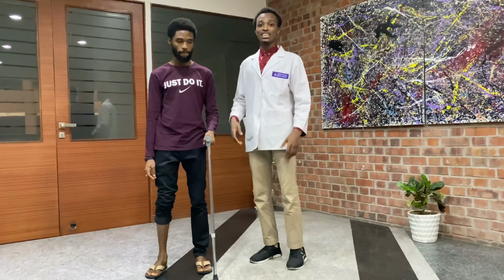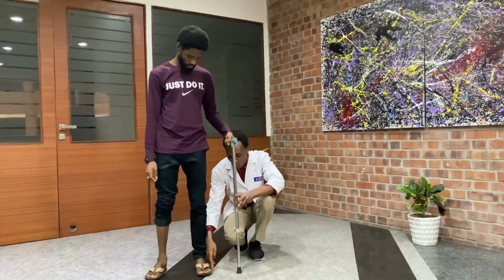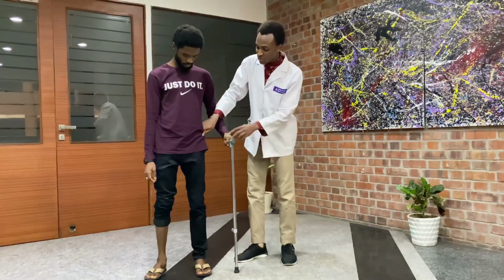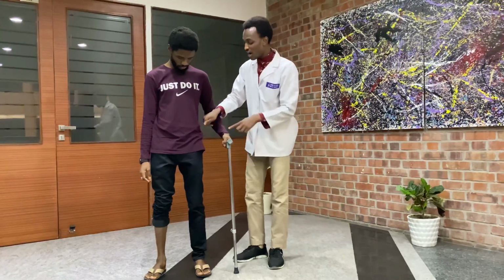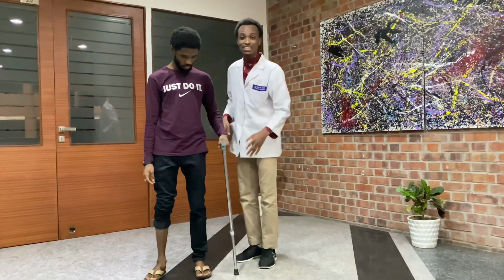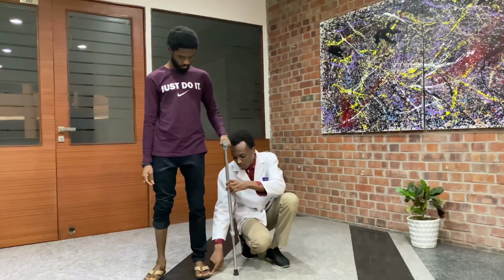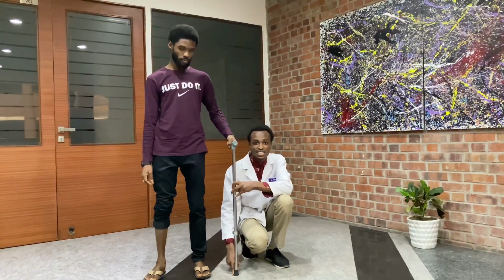Measurement of cane. The cane is placed 6 inches from the lateral border of the toe. Here is the lateral border of the toe, then we place the cane 6 inches. Then we measure the cane from the greater trochanter of the femur to the point on the floor, or from the hand in gripping position, 15 to 30 degrees of flexion, to the point on the floor. That is literally how we measure the cane. And the measurement of the lateral border to the point here, we use a tape and measure it.